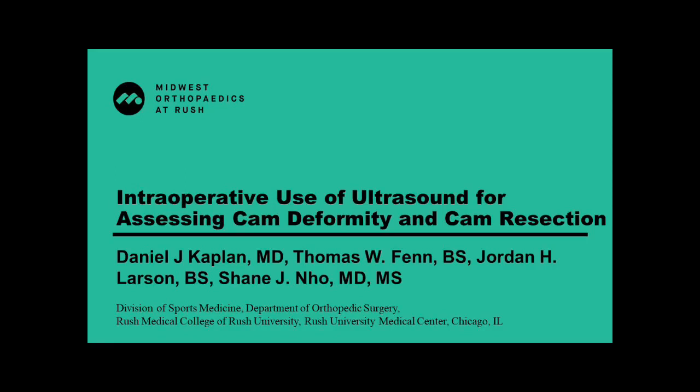The following is our technique for ultrasound assessment of cam deformity.